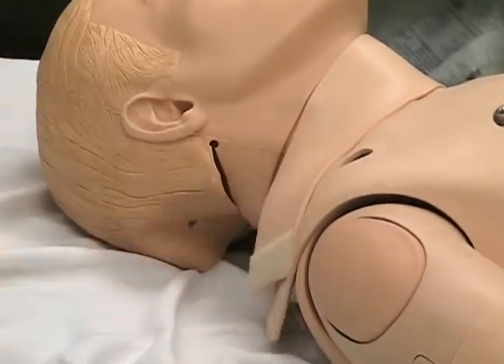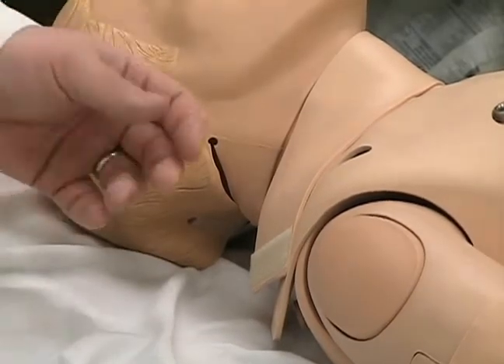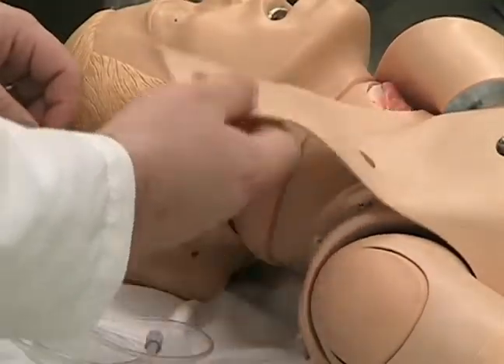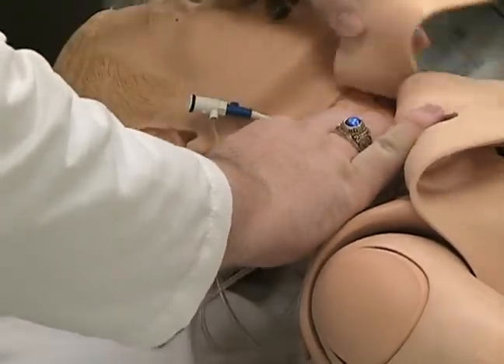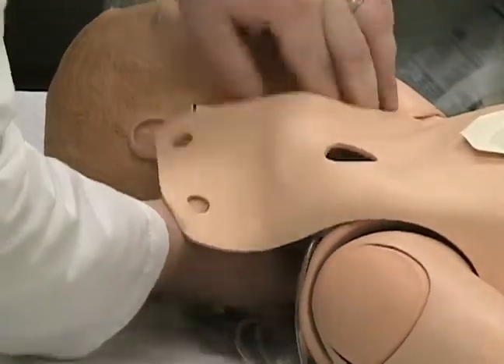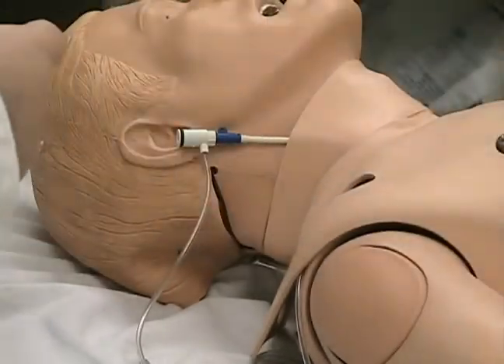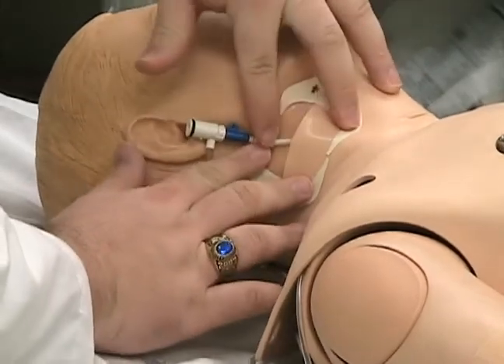Now we moulage the mannequin. Loosening the neck and chest skin, we have access to place our central line. Take the central line adapter that we made previously and place it underneath the neck skin in the approximate anatomical position. Once you find the position you like, we now reattach the neck skin. Apply a Tegaderm as a dressing, and this will complete the moulaging of the neck.